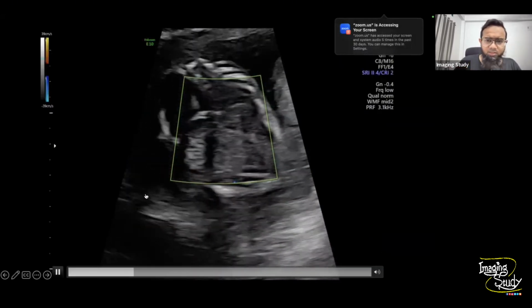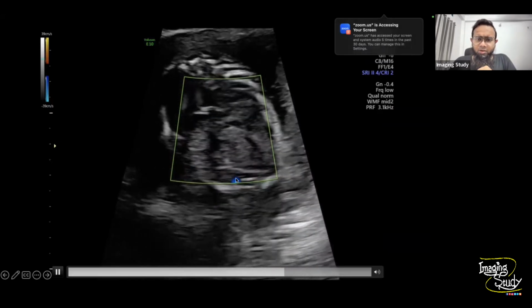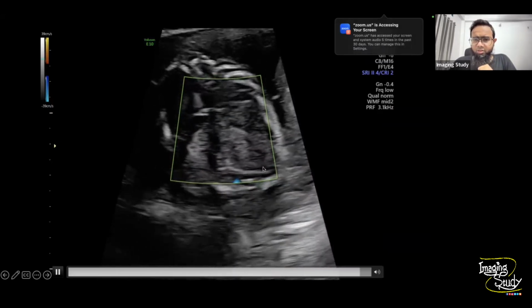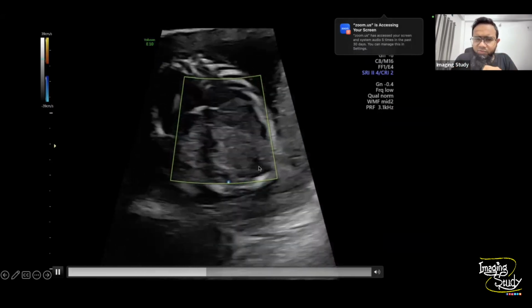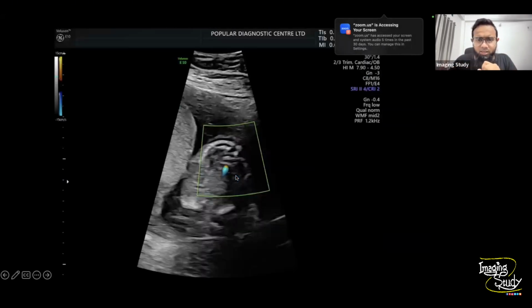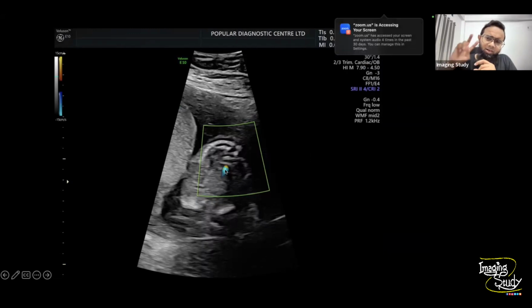Now you can see at the lower abdomen, there was only a single vessel, there is no vessel at this part. This might be a confusing view, so let's ignore it. At the lower abdomen, this is the area of the bladder which already got evacuated. So we see only a single vessel, that is a single internal iliac artery in this patient.